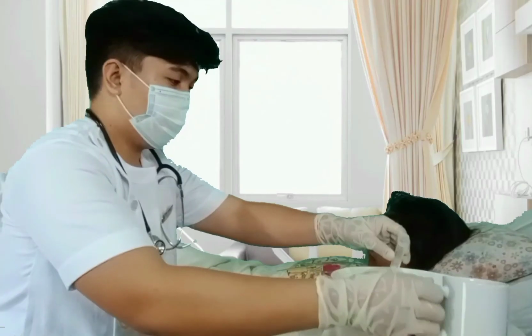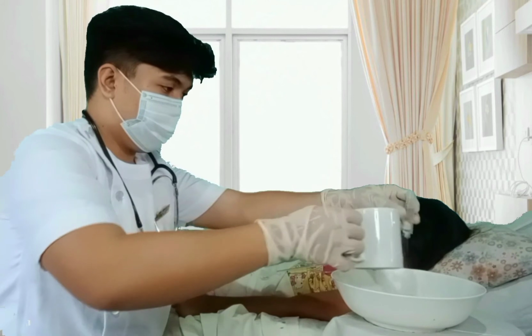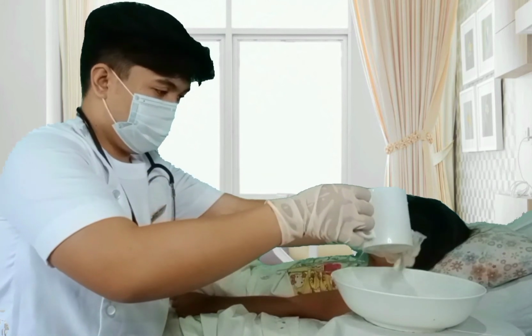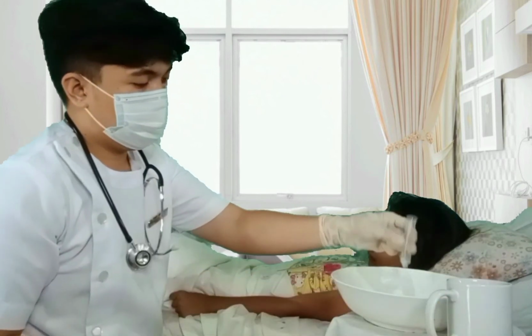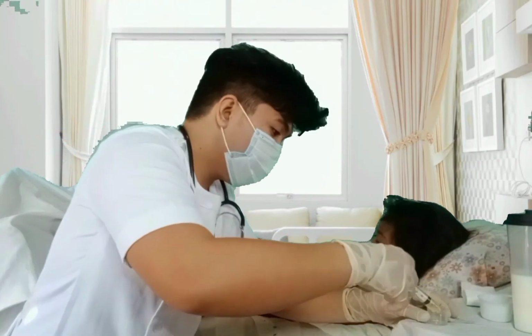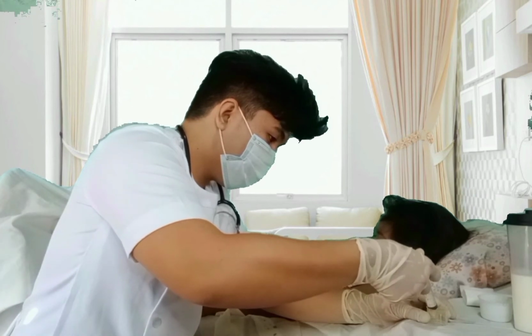Step 10. Rinse bag and tubing with warm water whenever feedings are interrupted. Rinsing bag and tubing with warm water clears old tube feeding and reduces bacterial growth. Step 11. Measure amount of aspirate residual every 4 hours. This evaluates tolerance of tube feeding.